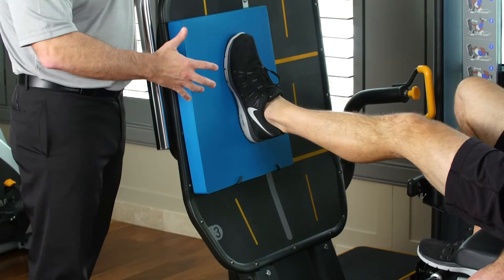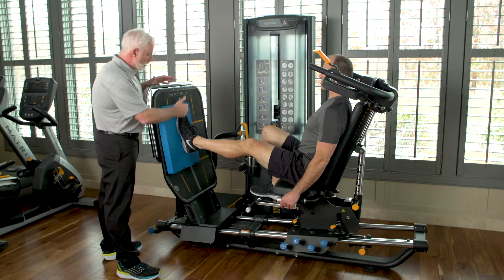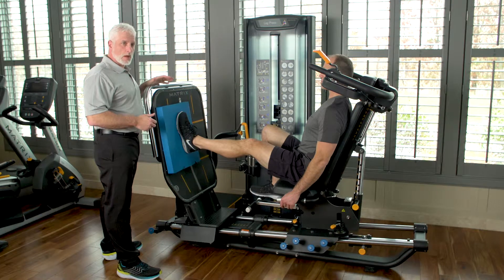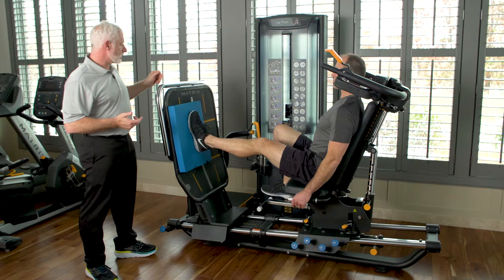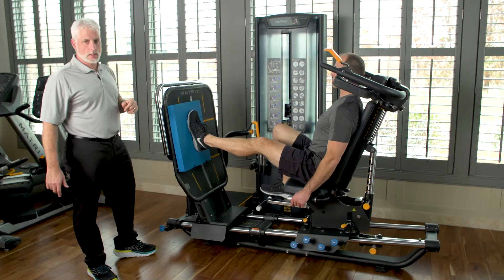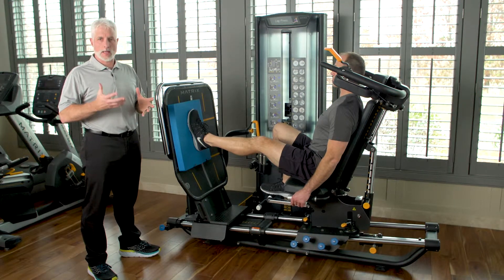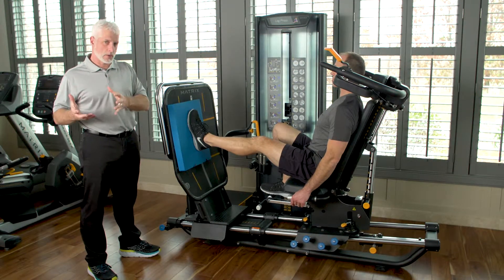He can put his foot here, lower, or higher on the pad. One thing I recommend with these types of patients is that they actually look at the top of the leg press as they do this activity, because that promotes sensory integration — their brain is talking to their muscles while they're actually performing the movement.